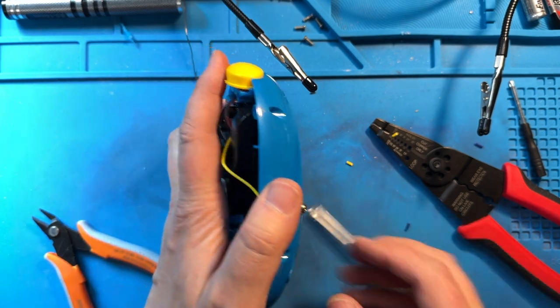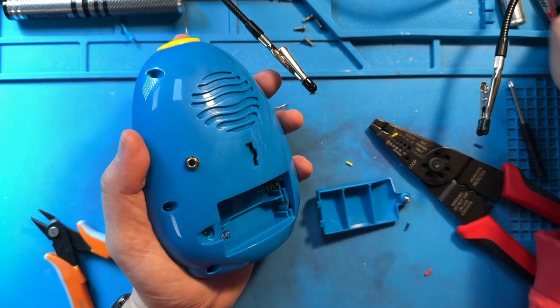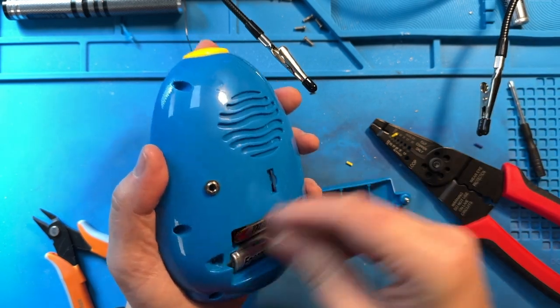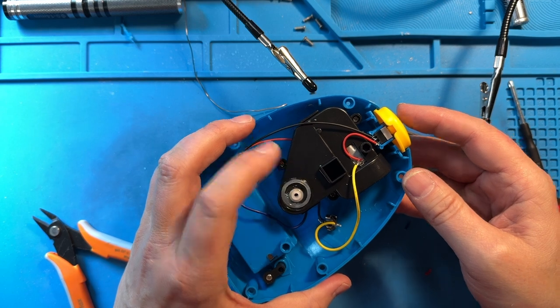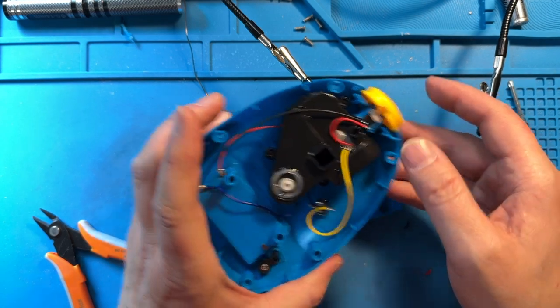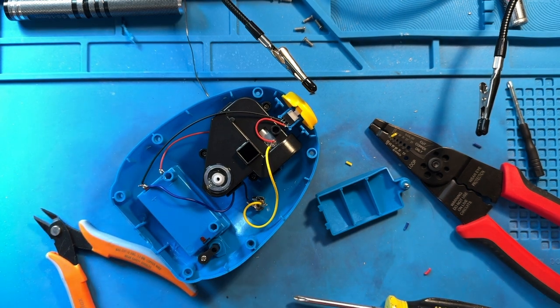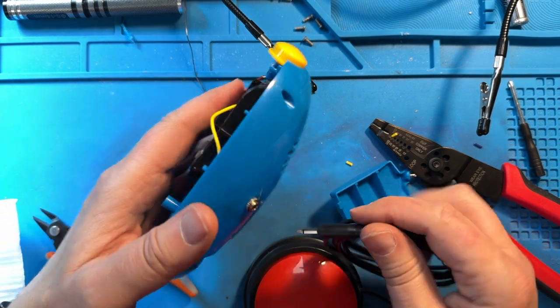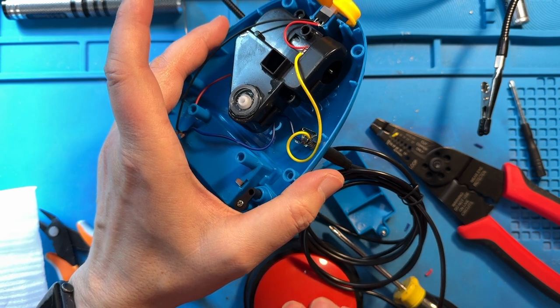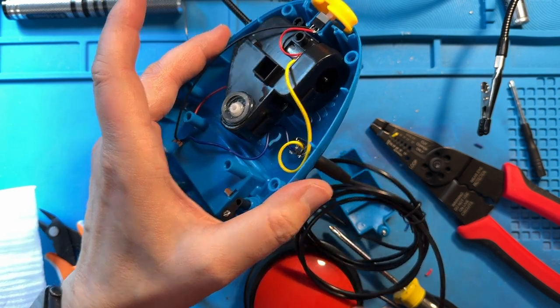I'm going to pop those batteries in and push the button. On and off — great, it still turns and it blows air. Perfect. The other thing I'm going to do is grab an assistive switch and plug that in as well to make sure our jack is soldered appropriately. I grab my jelly bean switch and plug that in, then push — works great. Perfect. Now I know that we're good to go.